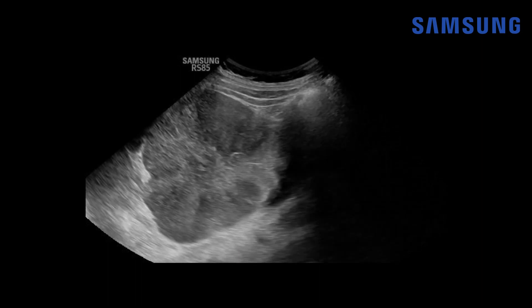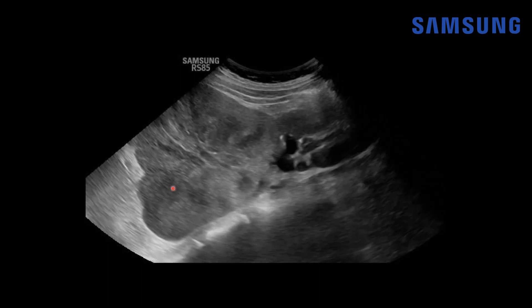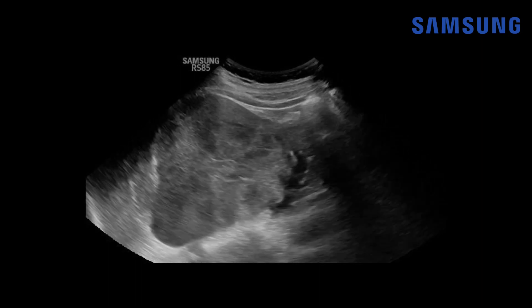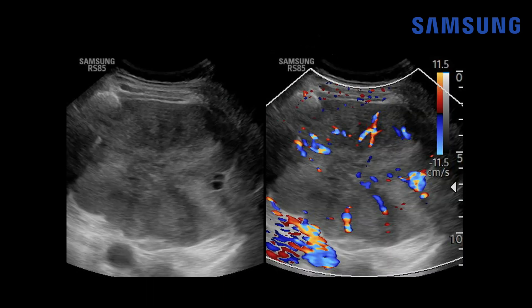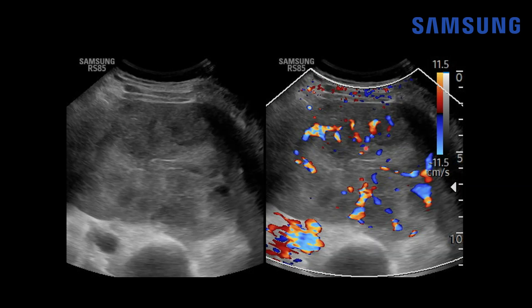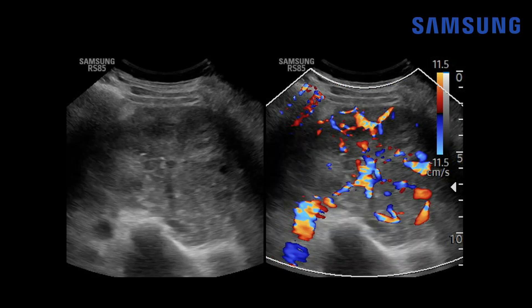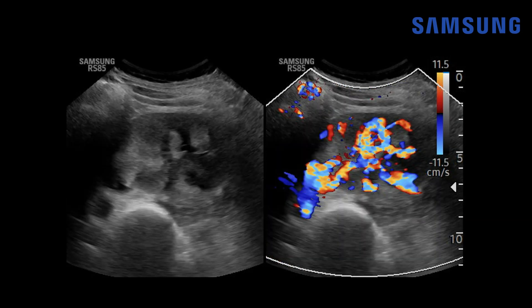The sagittal sine image nicely shows it exophytically arising from the kidney, and notice that echogenic stellate scar within the central aspect. When we add color Doppler, the mass is quite vascular and you can see a feeding vessel leading to the mass. On dual screen images showing grayscale and color Doppler, notice how the color Doppler is arranged in a radial array — almost a spokewheel pattern approaching the center of the mass.